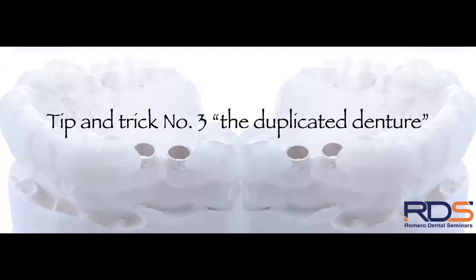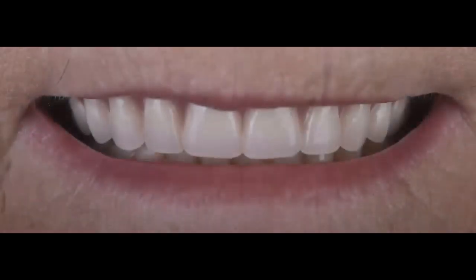So now we're going to talk about a patient that has no teeth, and we want to place, let's say, 2 mandibular implants in order for us to do a mandibular overdenture. And specifically, this is what this case is about. This patient had 6 implants placed by a different provider on the maxillary arch, and we were now getting ready to expose, to do second stage on the maxillary implants, and then pick some locator abutments for her upper denture. But at the same time, she wanted to improve the stability of the lower denture.